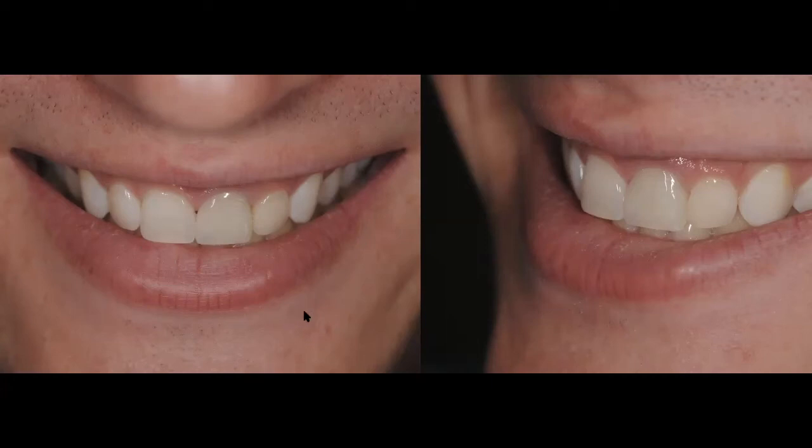And we can all agree that even though the restoration kind of looks like the neighboring tooth, I'll tell you, a couple of things that I see are wrong with the tooth. This appears to me, in my eyes, to be a very flat tooth. And when you look at this side photo, I want you to look at the mesial line angle of the natural tooth, tooth number 8, and the lack of a very nice mesial line angle for tooth number 9. So tooth number 9 appears to be flat because it's missing this mesial line angle.